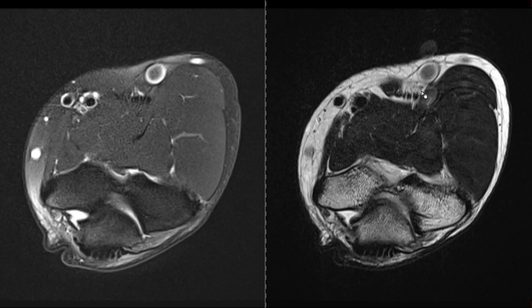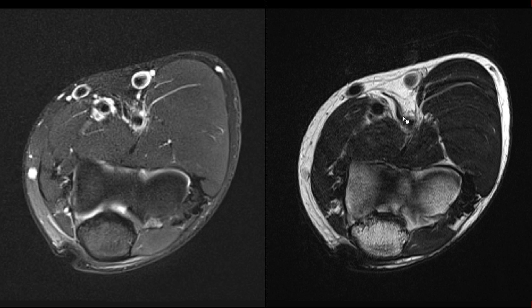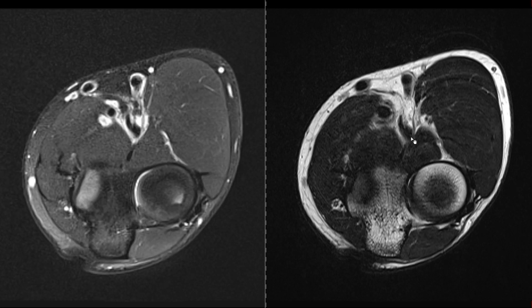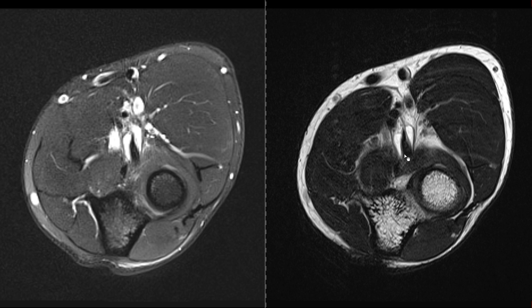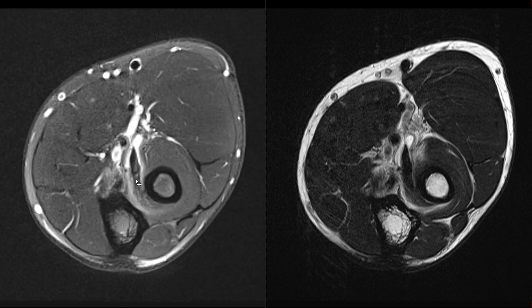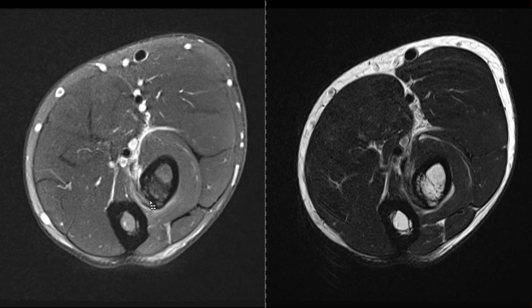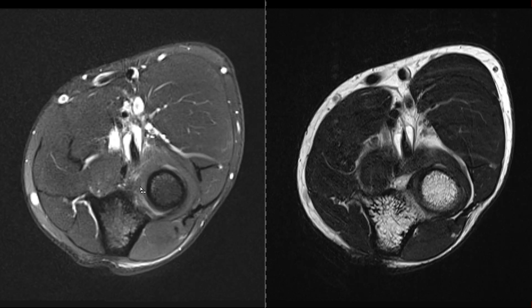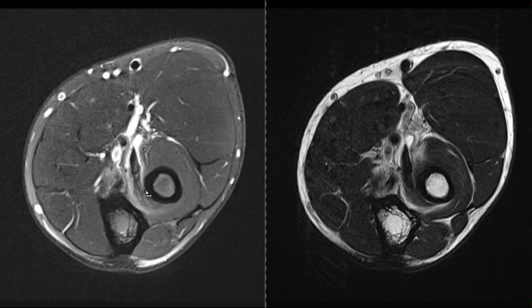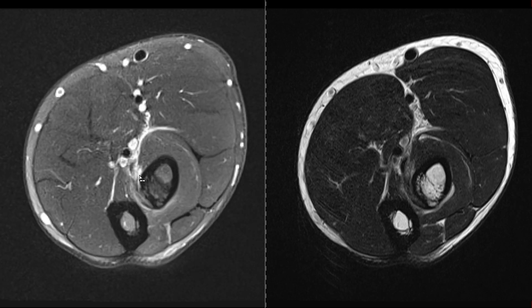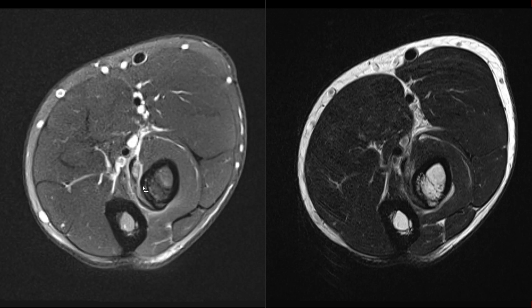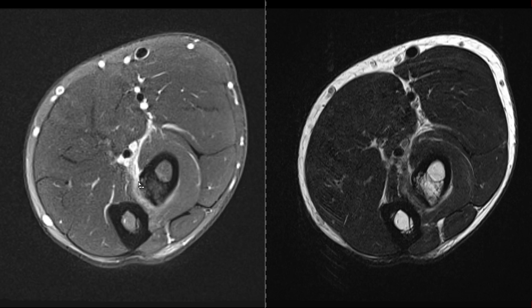Starting proximally on the axial views, we have the two components — the long head and the short head — as well as the lacertus fibrosus, which is intact. There is fluid around the tendon, better depicted on this fat-saturated sequence. Following the tendon distally, there are signal changes and only some fibers are inserting into the radial tuberosity. Clearly the long head is also partially torn, and there is complete discontinuity of the short head, which is completely absent here.